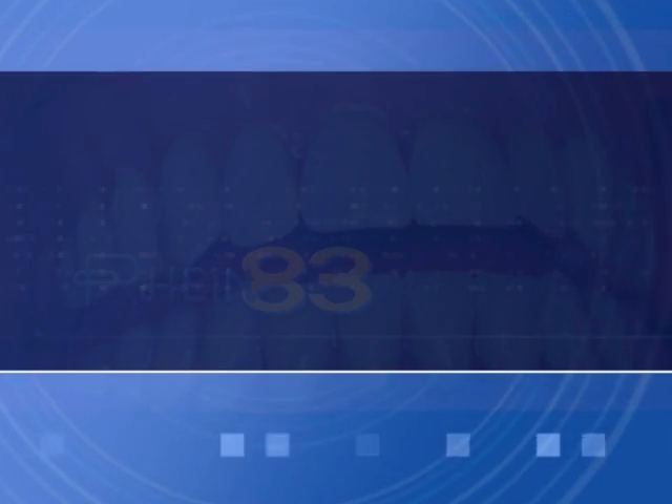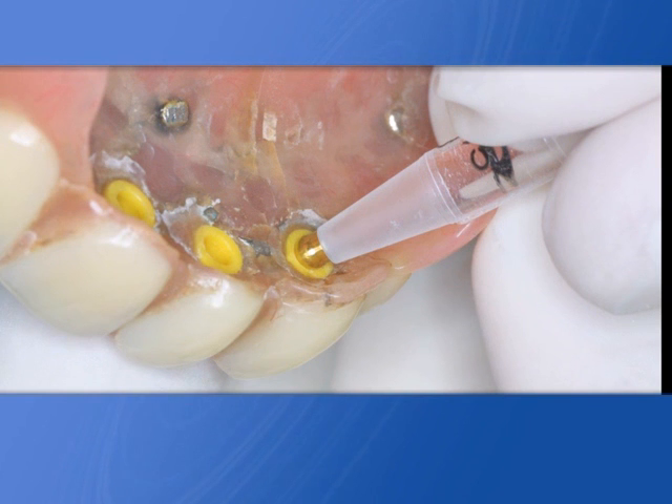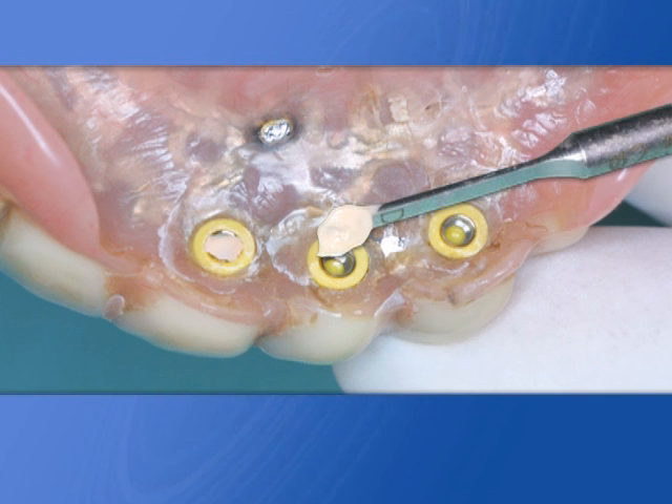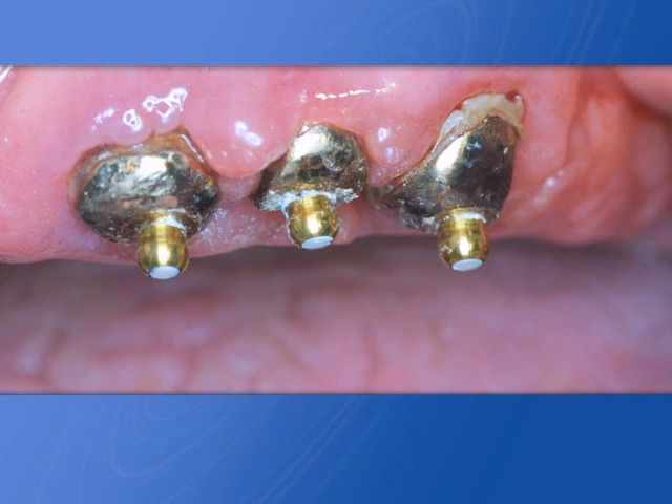In some cases, use a burr to reduce the worn sphere dimension, then insert the concave sphere into the retentive cap. Fill the concave sphere with cement and have the patient bite down on the denture. When cement is cured, remove the denture and polish excess.